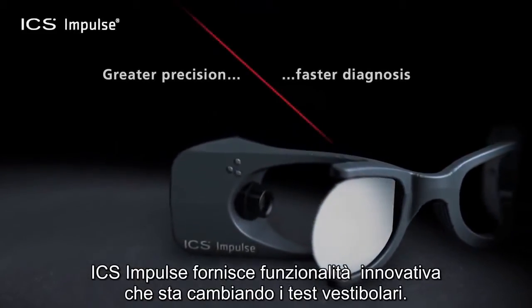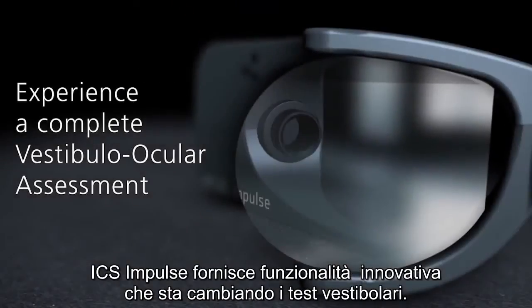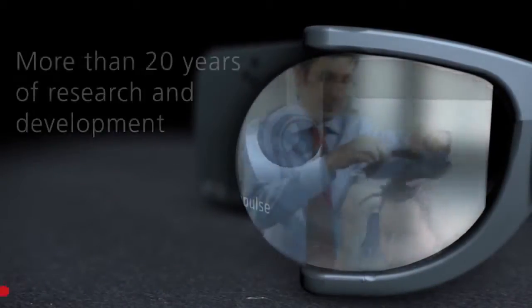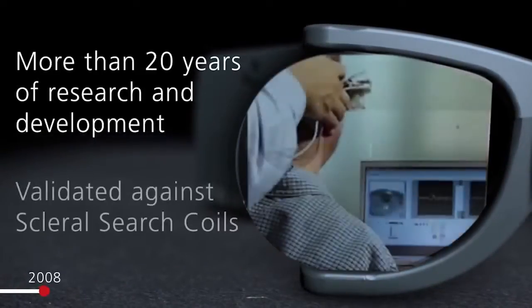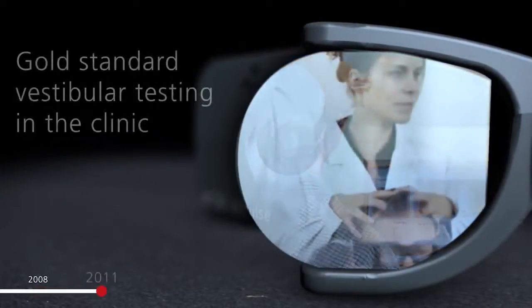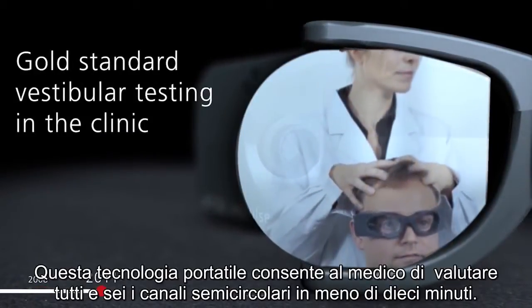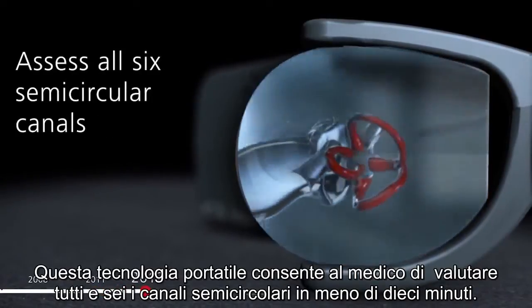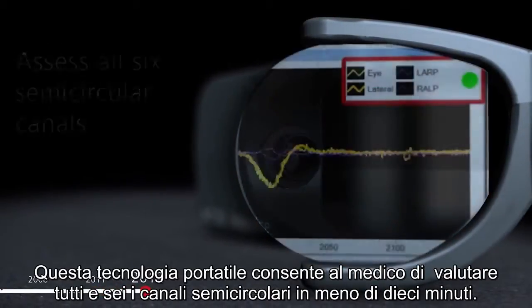ICS Impulse is providing groundbreaking functionality that is changing vestibular testing. This breakthrough portable technology enables clinicians to assess all six semicircular canals in less than 10 minutes.